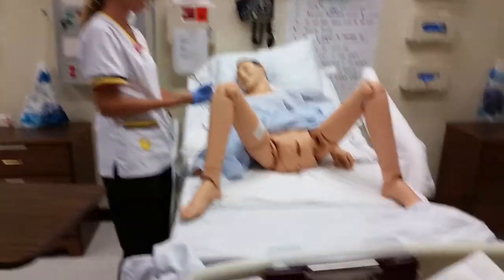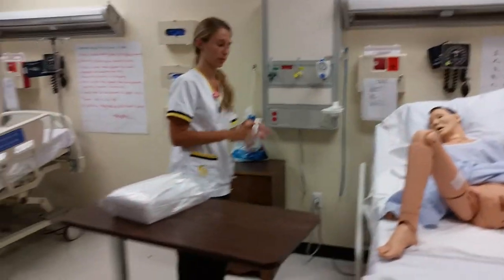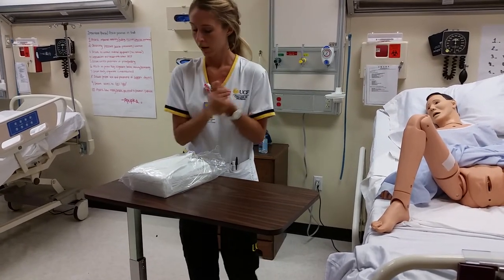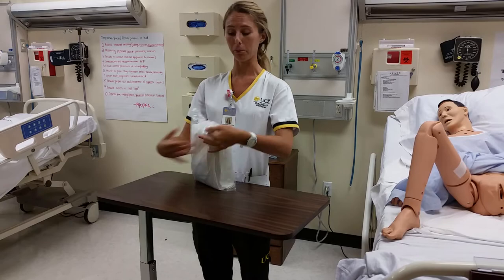Okay, so I'm going to go ahead and take these off, and I'm going to go ahead and set up my sterile field, and it's really important to make sure the patient doesn't move around too much to contaminate it. Okay, so here's my hand hygiene. Okay, so here is my catheter kit. In real life, this won't be open.